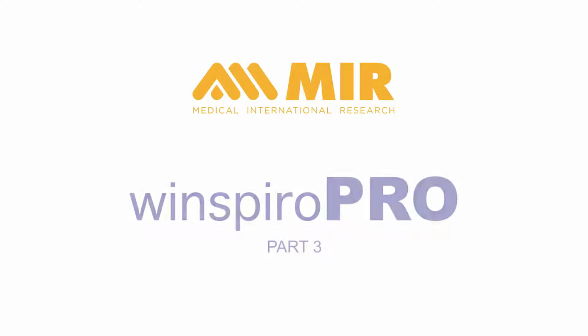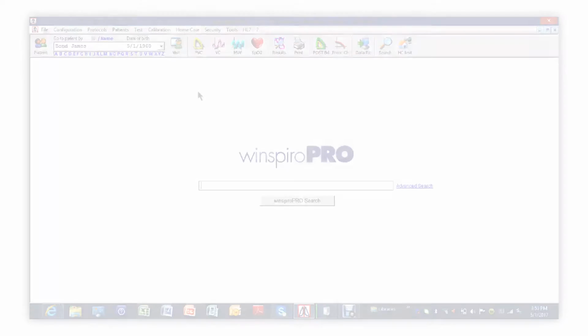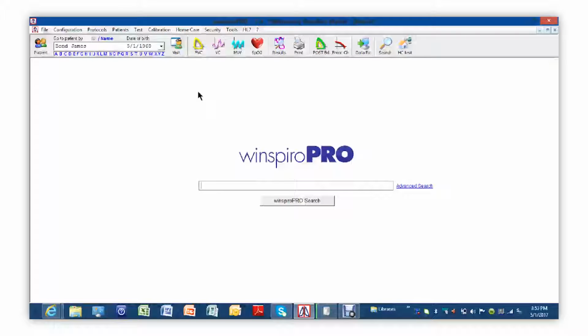This is the third and last of 3 videos that will provide you with a basic demonstration of how to install, set up, and use the MIR WinspiroPRO spirometry software connected to any MIR spirometer. In this video, we will be doing the FVC test.